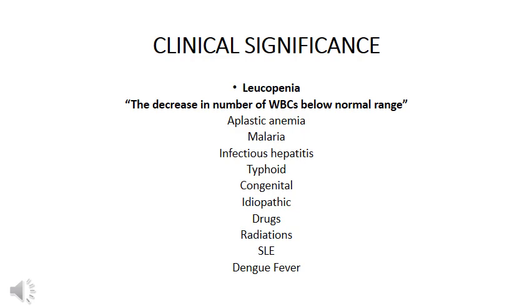After multiplication we will divide this by the volume of the chamber. The volume of the chamber is 0.4 in the large scale boxes. So after multiplication we will divide the answer by 0.4, and we will get the total leukocyte count per cmm. So the unit is cmm, cubic millimeter.